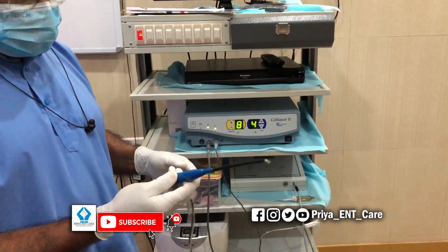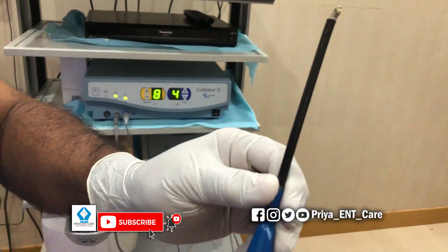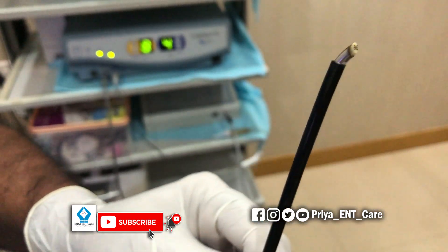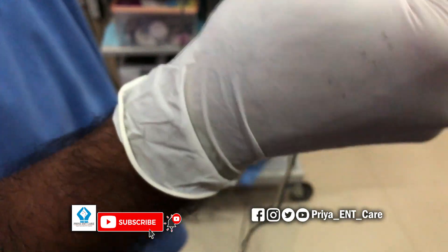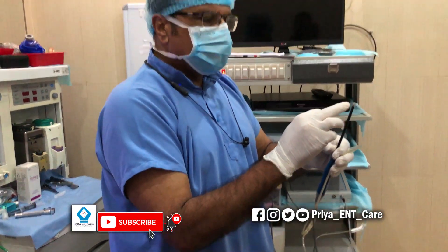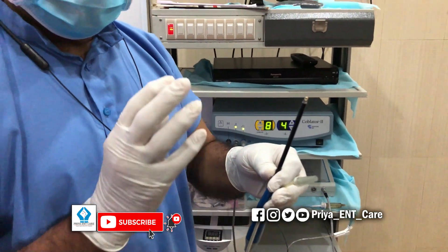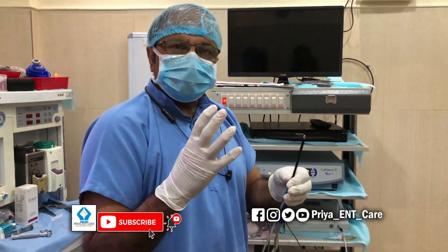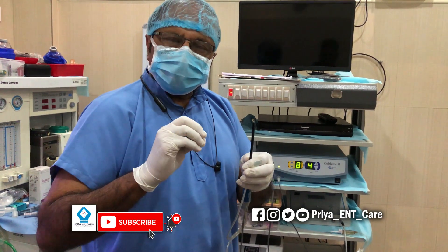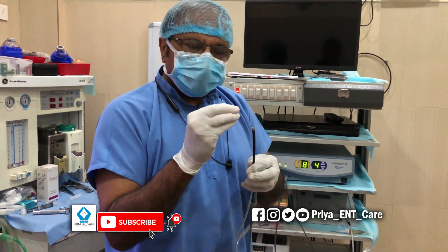Now, how does this coblator work? This is the wand of the coblation machine, and here you can see the filaments of the machine. This is the tube for saline to come into the wand. Radio frequency waves come out through these filaments into a layer of saline. The sodium and chloride ions in the saline are excited and become ionic, forming an ionic plasma at the end of this wand.